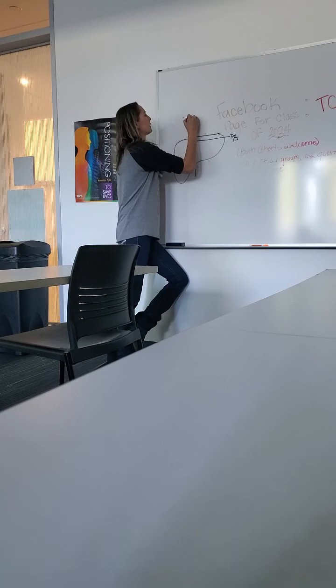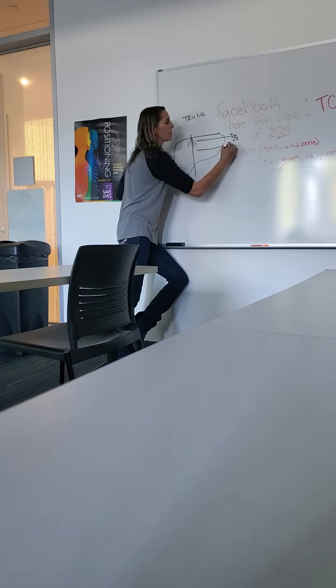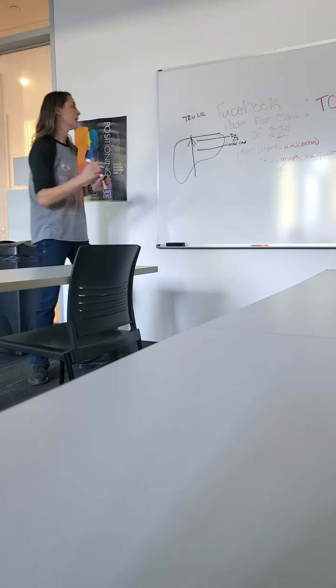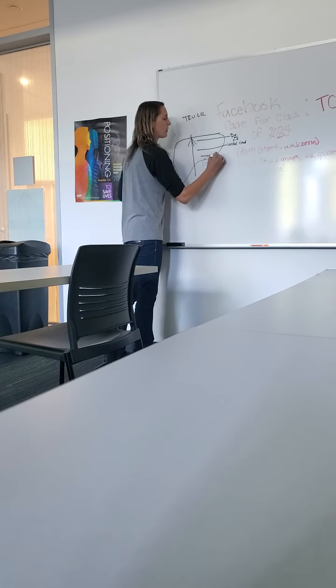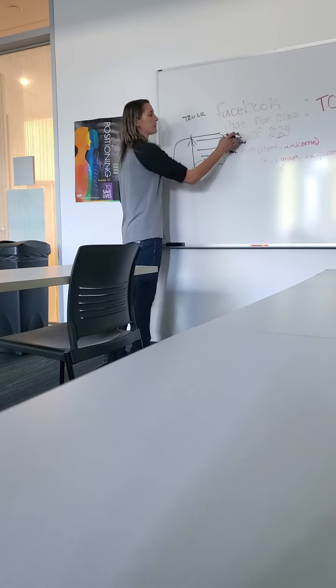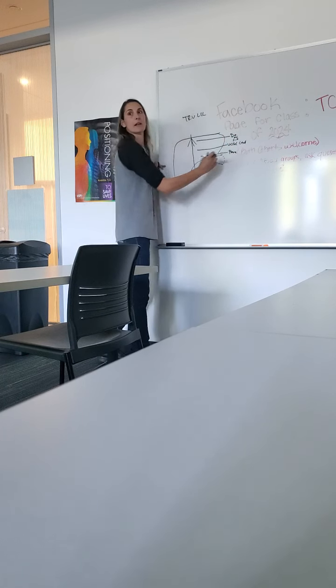So it's gonna be our superior image, and these are all, again, annotated transverse left liver lobe. We're gonna have one in the mid, what we call kind of vessel land. So you may have some hepatics in there, you may have some portals in there, you just wanna show off some features of that liver. And then we haven't really played with the pancreas yet, but he's gonna live down here. So our inferior one may or may not have panc in it. We kind of call that panc land. So we're gonna have a superior at the dome, a mid at vessel land, and an inferior at panc land.